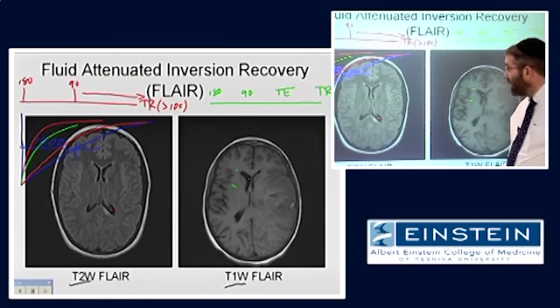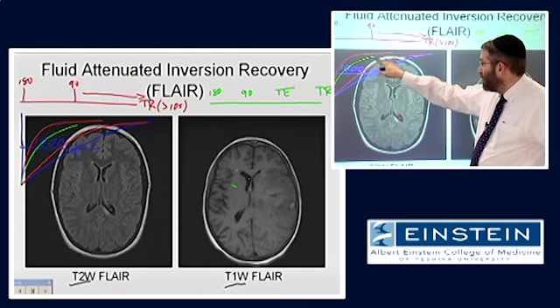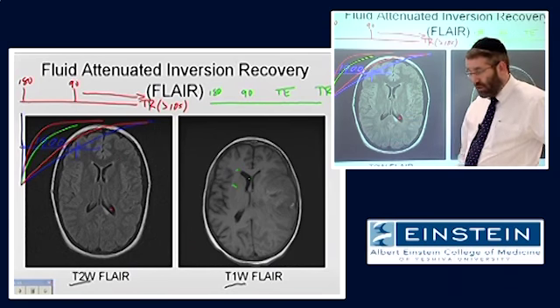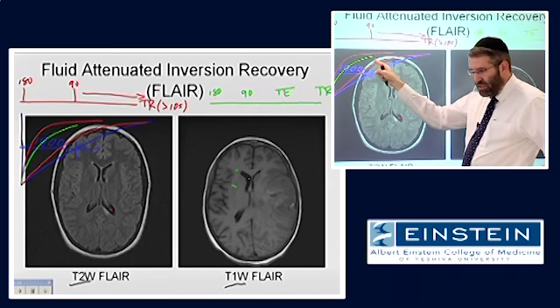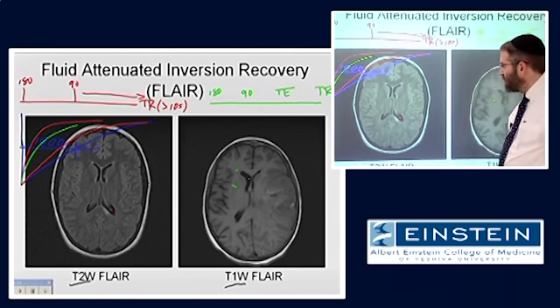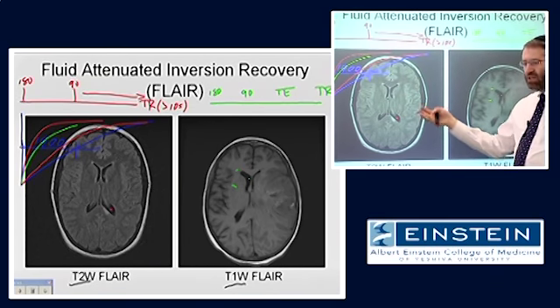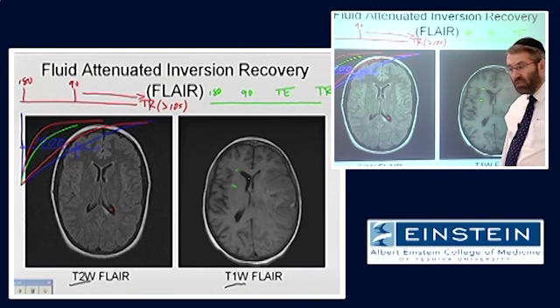But on the other hand, this approach will bring out contrast between this tissue and the others. But that's a T1 contrast. My point was just that we look at this image, and if we ignore the CSF, the contrast in the image looks like a T2 weighted image.